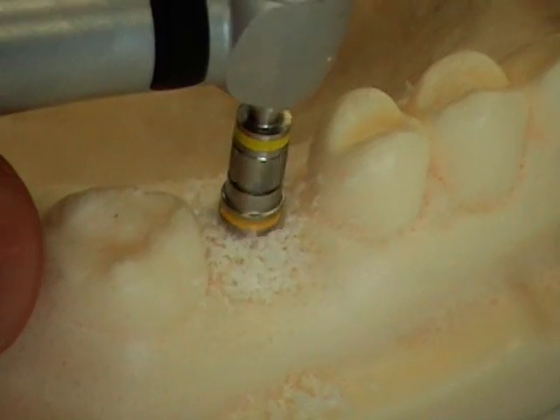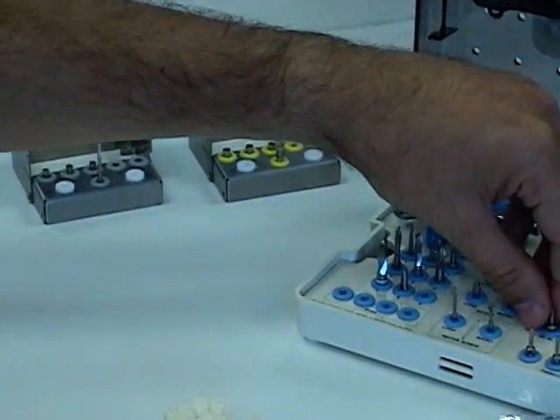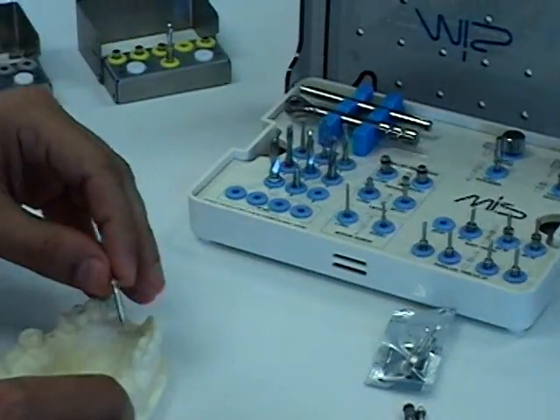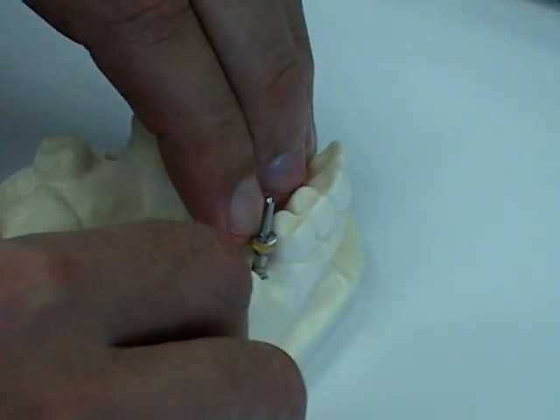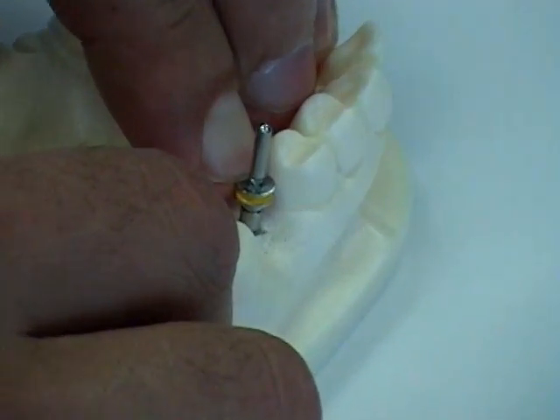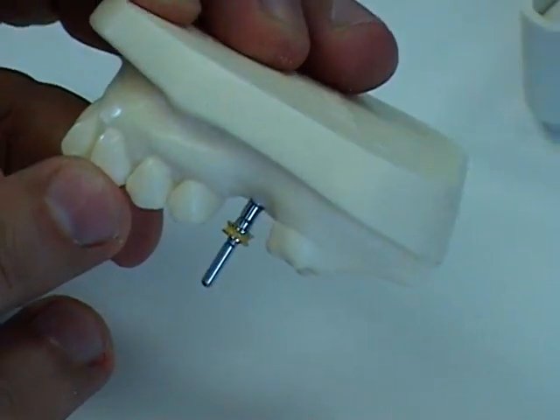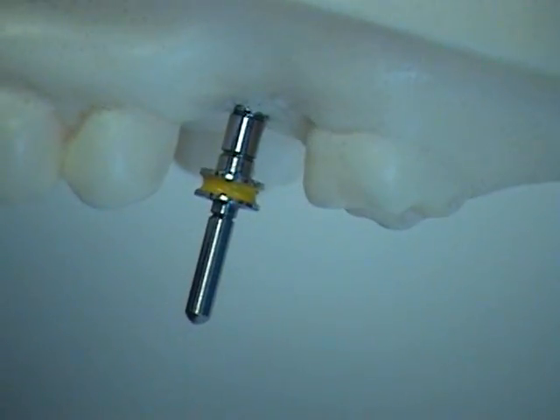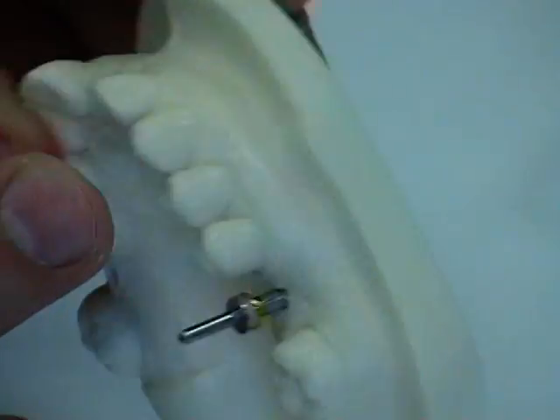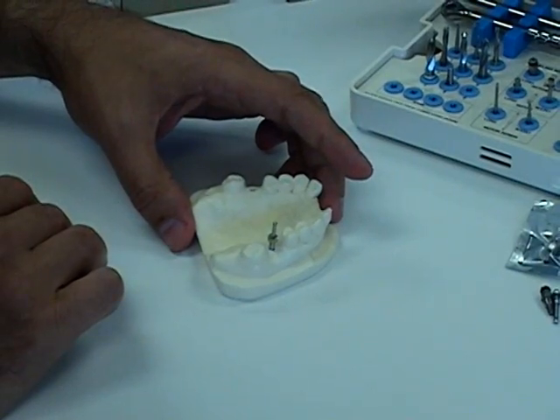Once we're done with the 2.8mm drill, we're going to use the 2.8mm body try-in, also color-coded yellow. This will do several things. First, it checks to make sure that the depth is also 13 millimeters. You can do a periapical x-ray to verify the direction of the osteotomy compared to the neighboring teeth, and also verify that the osteotomy is in the center of the ridge.